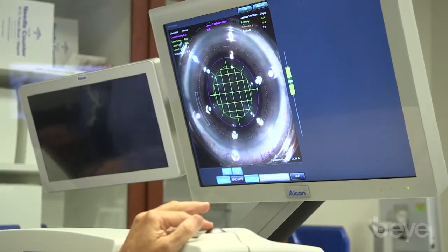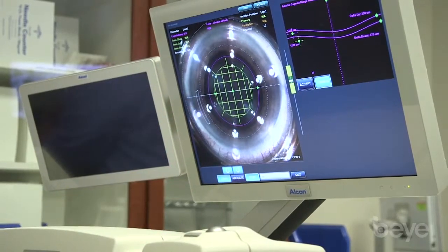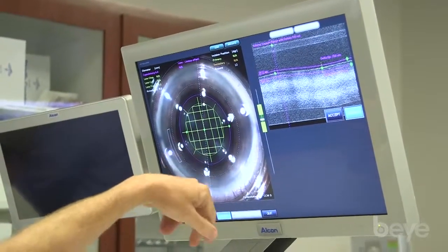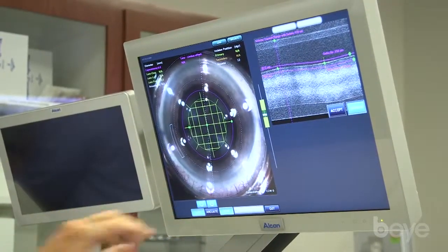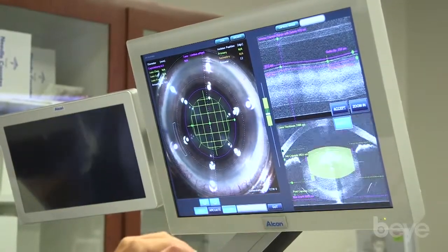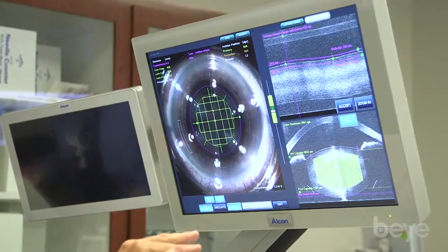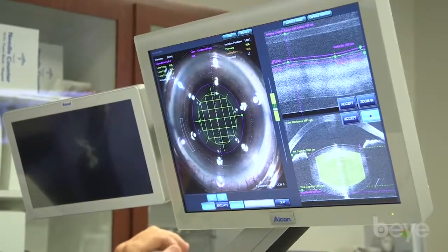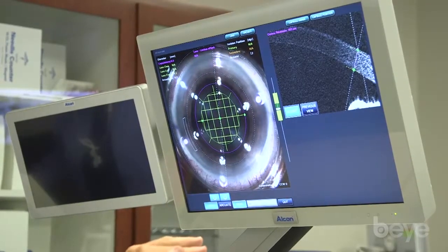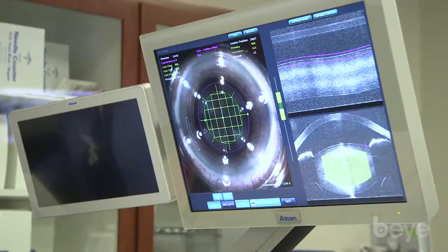Once we have everything in good position, we hit scan, which is going to scan the anterior segment. This is an OCT-based imaging system. First it identifies the capsule, which it automatically recognizes. After we hit accept, it then recognizes the lens and finds the lens treatment — you can see it drops the treatment perfectly between the anterior capsule and the posterior capsule. We accept that, then check the arcuate parameters, where it automatically finds the anterior and posterior corneal aspects. We accept that, then hit verify and accept.